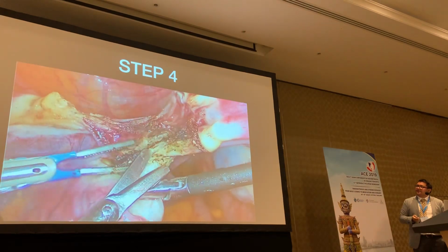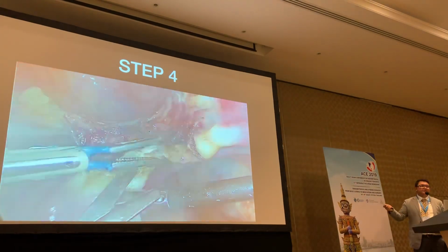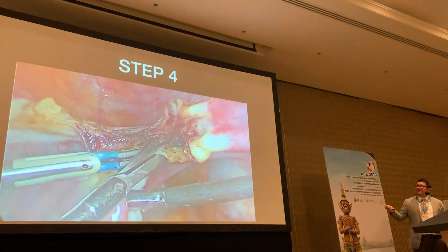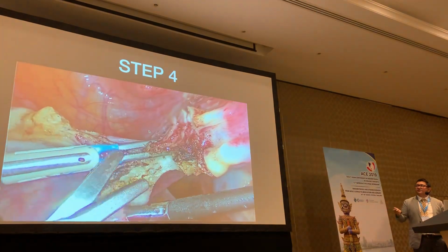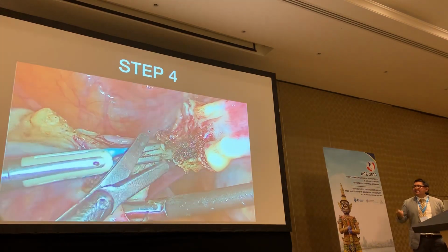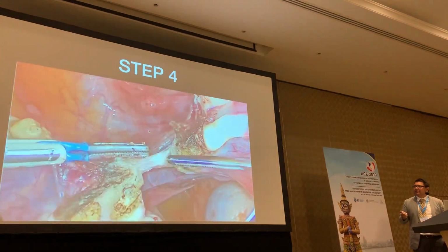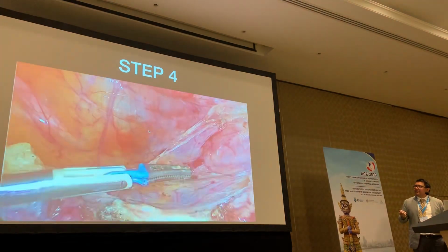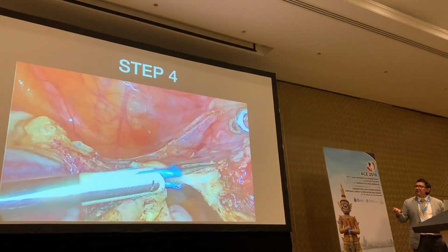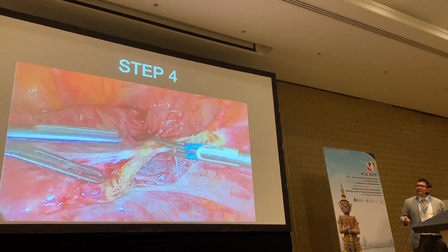So, the trick here is to hug the ovaries. Again, don't run too close to the uterus. You're going to get a lot of back bleeding there, which just looks untidy, and it also absorbs color of the scope if you're using an inferior scope. So now this puts the broad ligament at a stretch. I have an interesting technique which I will demonstrate on the other side in a moment.